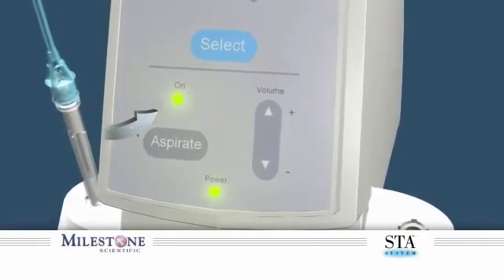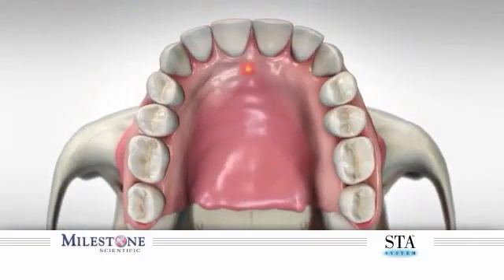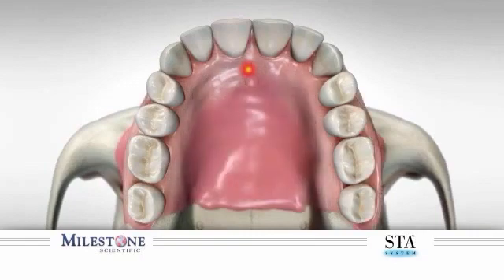Site of injection. This injection is initiated just lateral to the incisive papilla along the incisive groove while targeting the underlying nasopalatine canal. The objective is to gain entrance into the canal and maintain contact with the inner surface of the bony wall of the incisive canal.